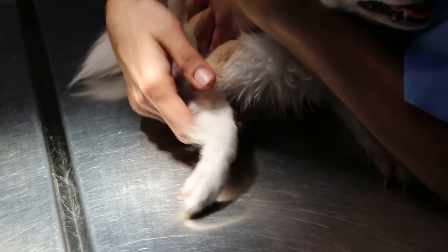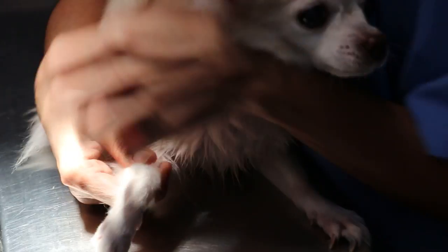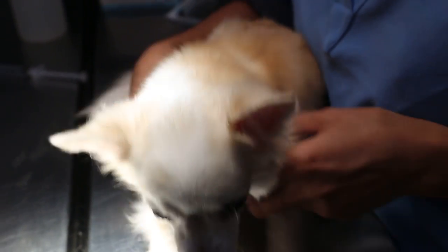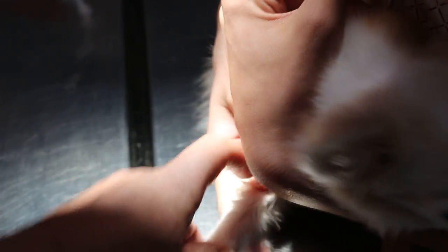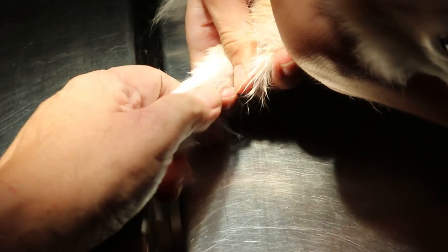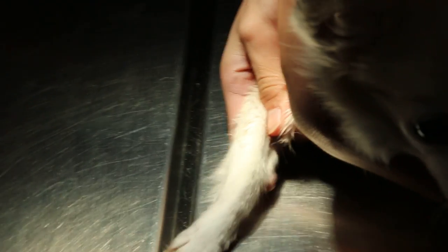This one controls the back. So you're not using your middle finger at the back. Get down a bit, just press this one — get down a bit. She can pull it. One more time. Close to your body. This one is at right angles — the thumb is at right angles to the leg. You know why it's right angles to the elbow. Then twist it, and then you can see the vein coming out. So you twist more, the vein will come further up.